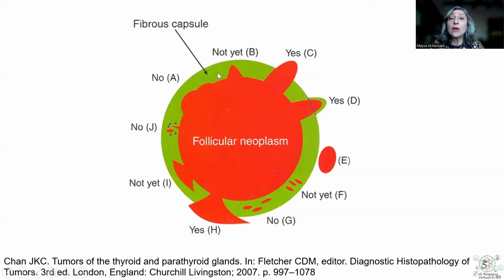Number one, we have to have a thick capsule, as is the case in our shared example. And this is the typical, what we usually study, that we have to see mushrooming of the tumor, the same tumor that is forming the bulk of the tumor within the nodule, mushrooming into outside the capsular component that surrounds the nodule.